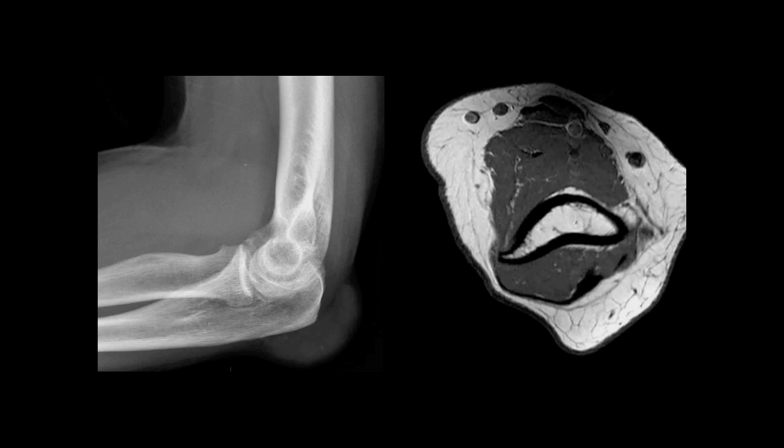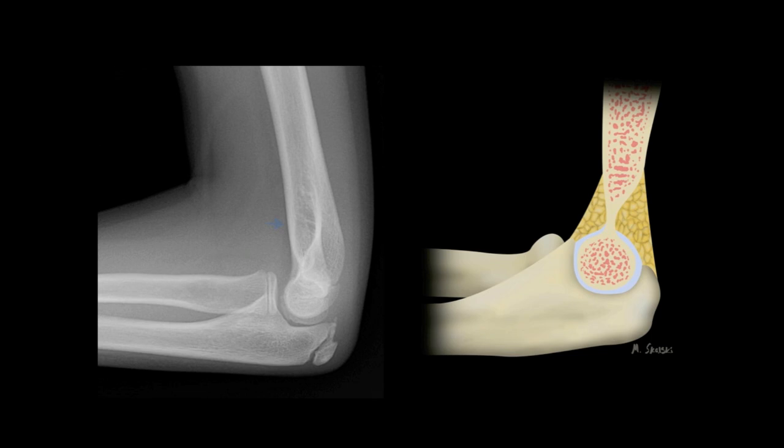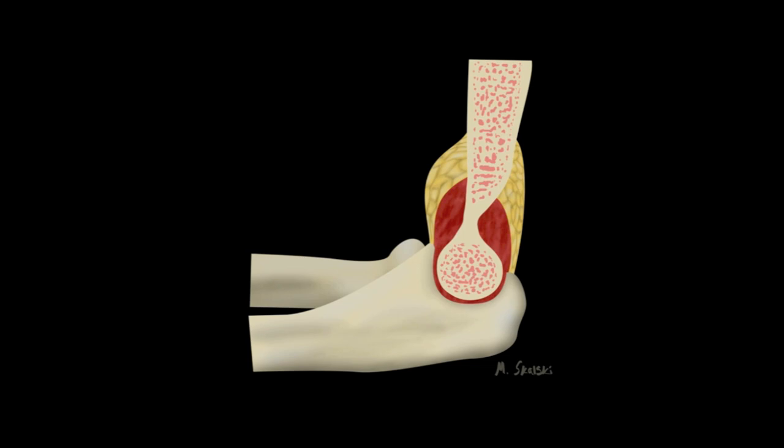As is normal, the posterior fat pad is not seen, as it is hidden within the olecranon fossa. These T1-weighted MRI images in a patient without a joint effusion demonstrate nicely why the posterior fat pad remains hidden by bony structures on a lateral image, while the anterior fat pad sits visible. Here is also an example of a normal child's elbow, which demonstrates the expected appearance of the anterior fat pad and an undetectable posterior fat pad.